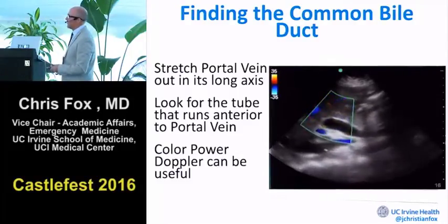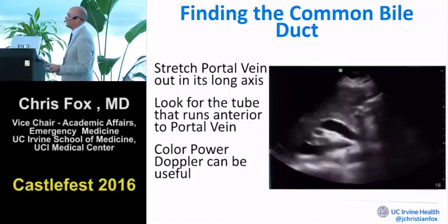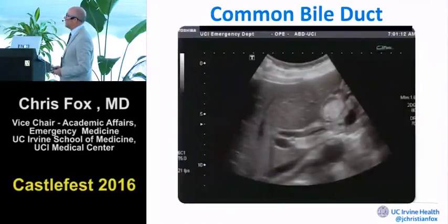And you can throw some color on here if you want to have fun with it and see the different vessels here. I don't usually do that routinely. But if you look at this case here, just the still image before I play the video, this is the IVC over here. The vena cava is coming along here. This is probably the aorta, not sure from a still. That's why we live in the video world in point of care. Here's that portal vein with its hyperechoic walls, and this is the common bile duct over here. This is the duodenum over here, some fluid in it or something, contrast, I'm not sure. And this is the hepatic artery looking at us here.